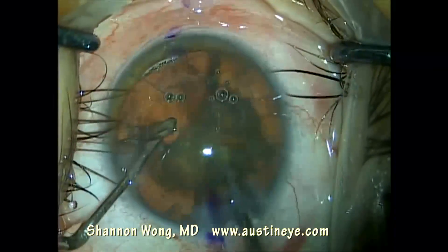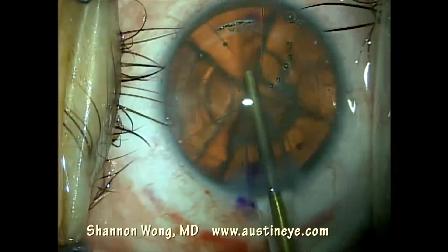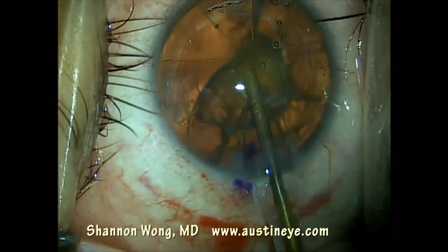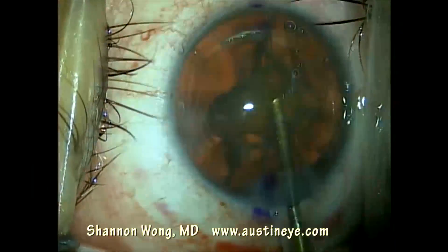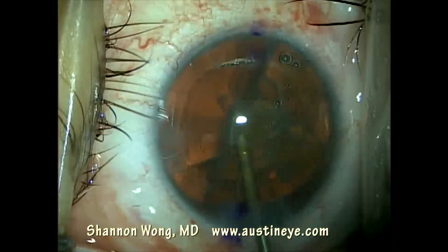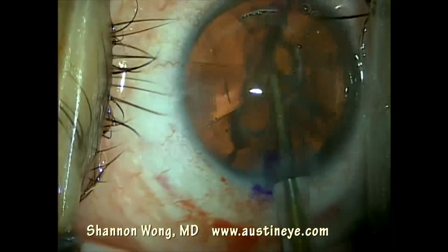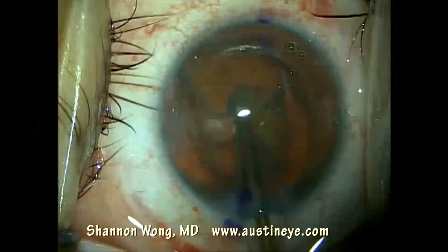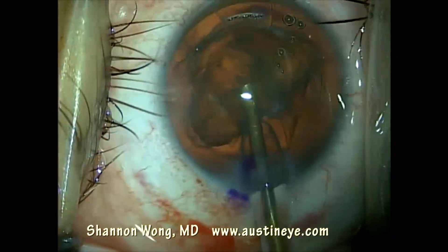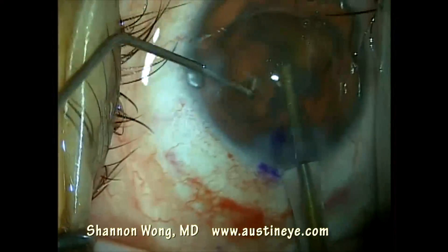The LensX laser does help to soften the cataract and facilitates removal with much less phaco energy than what we could achieve with basic cataract surgery. In this particular case, we've created an arcuate incision which you can see at 12 o'clock on the screen. I chose not to open this incision because the patient had prior RK and I got varying keratometry readings. I wanted to have this arcuate incision on standby, ready to be opened in the future should it be needed to reduce the amount of postoperative astigmatism.